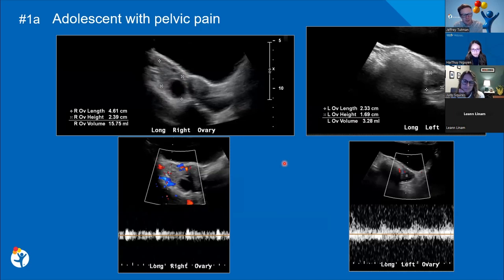I think that, Leanne, the ACOG guidelines that you showed, one of the other things they mentioned, I believe, is that a negative laparoscopy rate of up to 50% is acceptable in these cases of torsion. So I think it depends on provider to provider, but I think they really can have a pretty low threshold to take these patients to the OR. But like I said, I think that just highlights how challenging this can be from an imaging perspective.